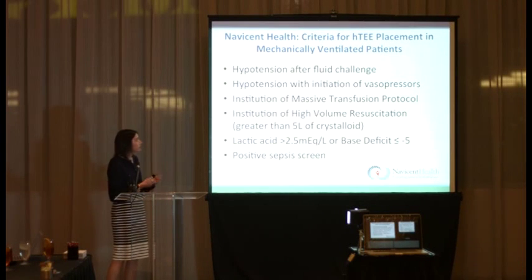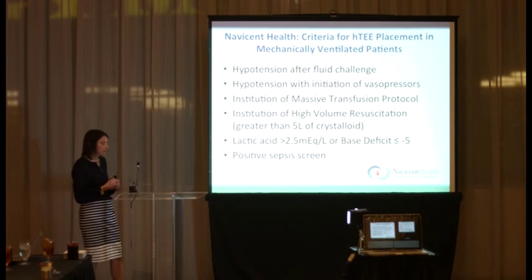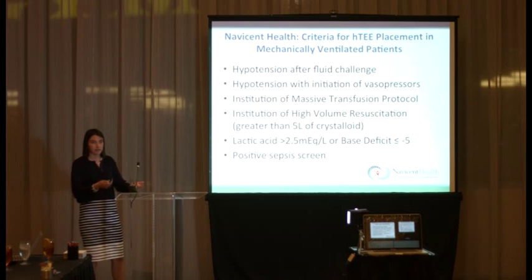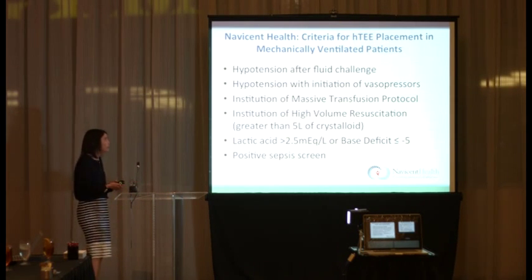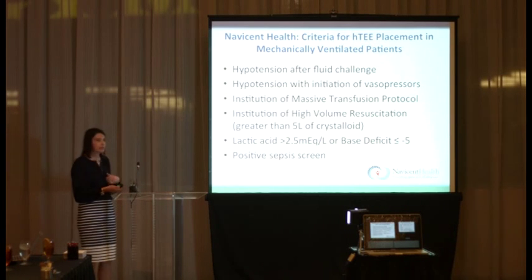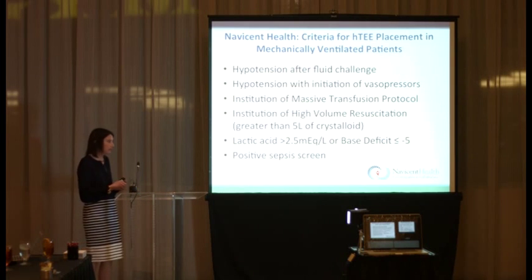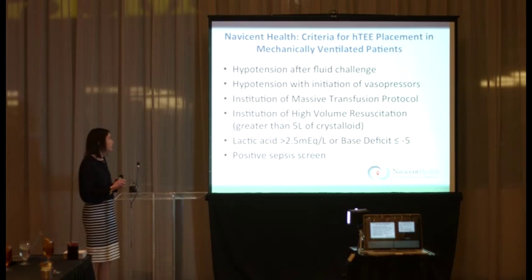The criteria for our hTEE placement, at least at Navicent, we've developed a list, and we're actually tracking our outcomes related to this. But this is our list, and every institution can develop their own specific to their needs. For us, we used hypotension after a fluid challenge, and this is not after a 500 cc challenge. This may be after a liter or two and really not seeing any change.